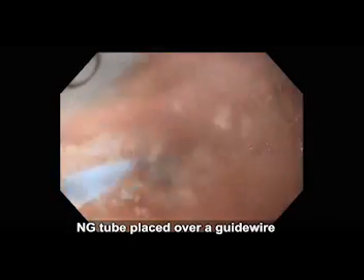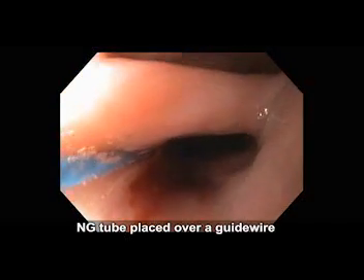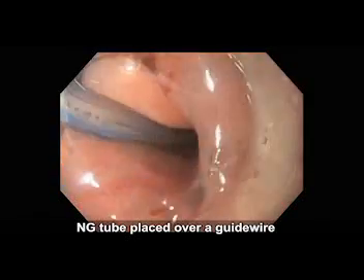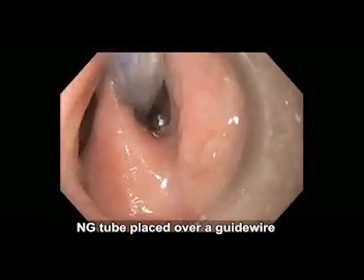An NG tube was first placed under endoscopic guidance and over a guide wire into the gastric lumen. This helped to further stabilize, identify, and better visualize the septum.